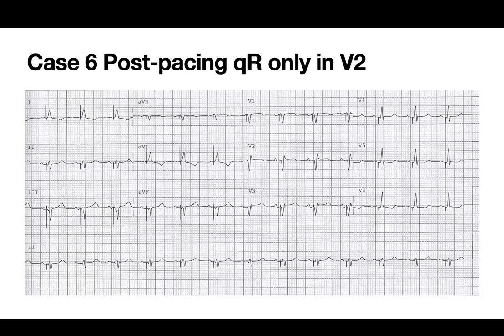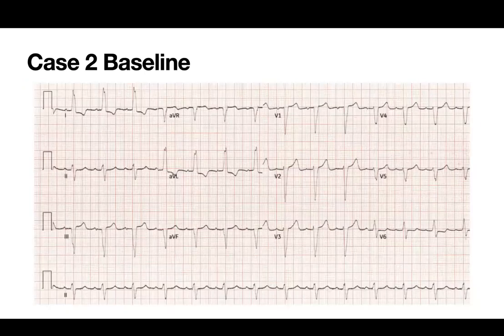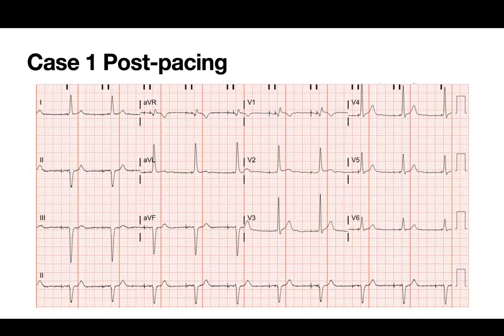Oh, yeah. I've had 2 cases where this happened, and I didn't think about it beforehand. I was putting the atrial lead into the ventricle to get some capture while I was trying to screw in the lead. Actually, the first one, can you go back, Jackie? Yeah, sure. All the way back. No, hold on. Yeah, the first case at the end, this was like this because the patient went into complete heart block when I was manipulating.